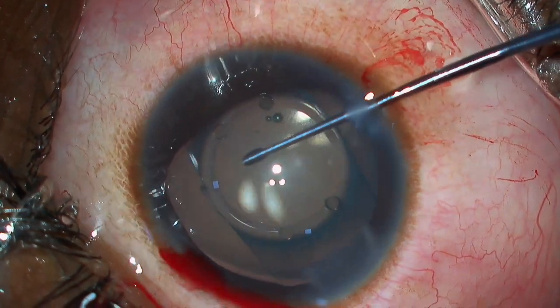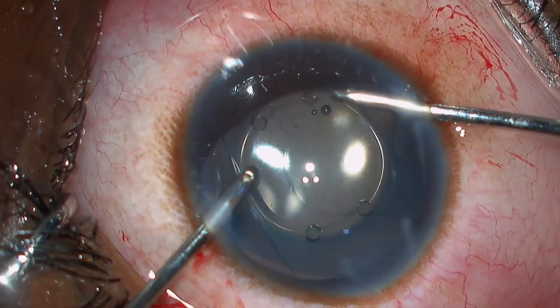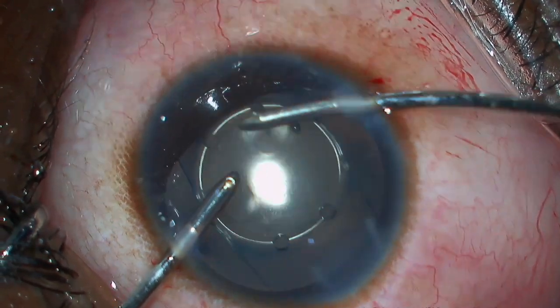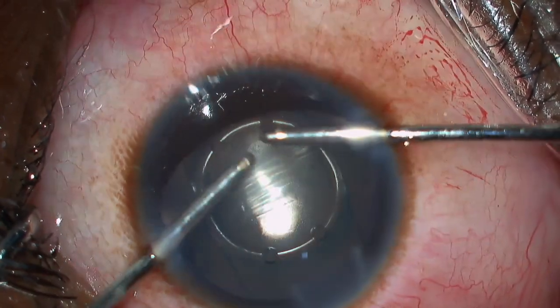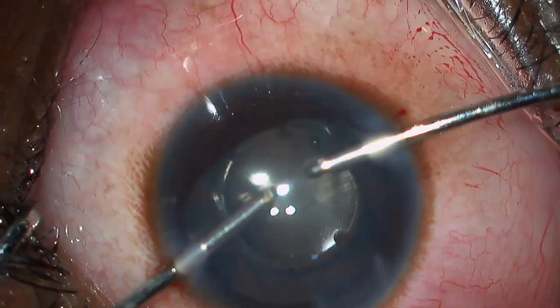After centering the RIL, the most important step is washing away the viscoelastic from the anterior chamber completely. Sometimes I place the irrigation port near the hole so that it goes under the lens and pushes away the visco between the RIL and the anterior lens capsule.